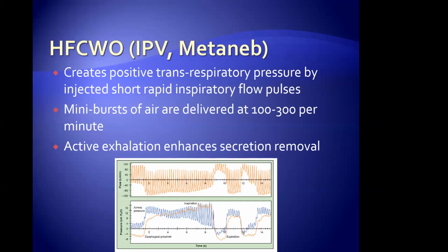When we first started doing IPV many, many years ago, I was thinking about when I was a student at the University of Texas Medical Branch in Galveston, we had, and probably you do too, a ward for cystic fibrosis patients. The kids would come in, and we would have to go and do it by hand, chest physiotherapy. Put them in Trendelenburg, left, right, and all like that. And after this came out, I said, man, where was that? When I was in school, this would have been great. Well, now that's the standard of care. So if you have that wing on your campus, you're already using this. You know exactly what that is.